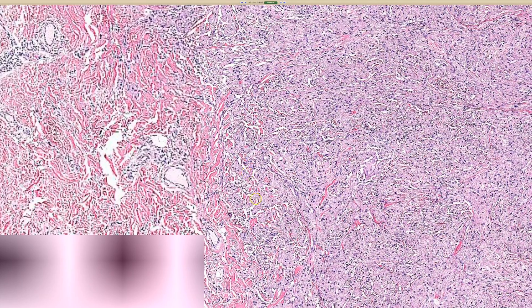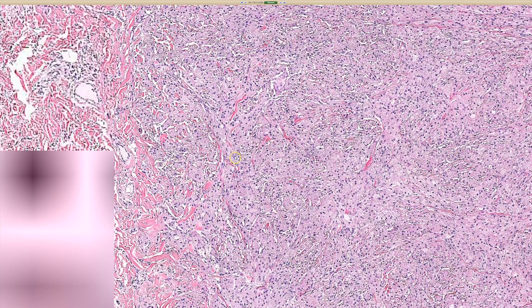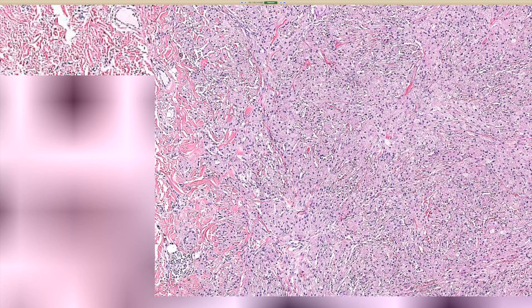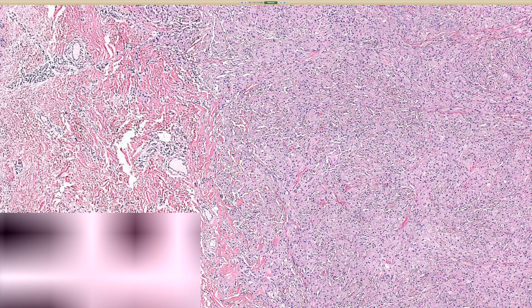At the periphery, granular cell tumor almost always has a feathery, infiltrative-appearing border, even if it looks circumscribed at low power. The cells crawl between the reticular dermal collagen bundles, intercalating with the collagen and trickling out at the edges — they are not encapsulated or sharply circumscribed. It's also very common to see granular cell tumor growing around nerve bundles at the periphery, because it is a nerve sheath tumor.